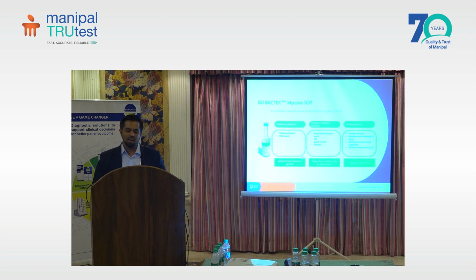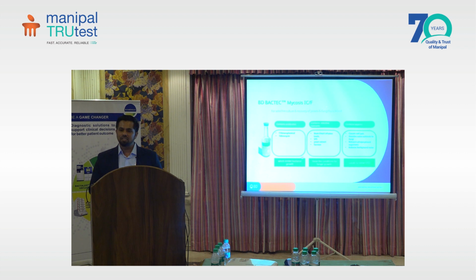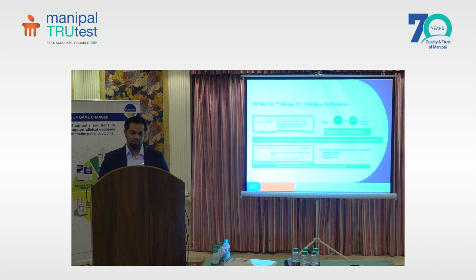Apart from this, it contains selective nutrients such as brain heart infusion, SPS, and yeast extract. I don't want to get deeper into this. So this is specifically recommended where we want to increase the yield of the fungus.